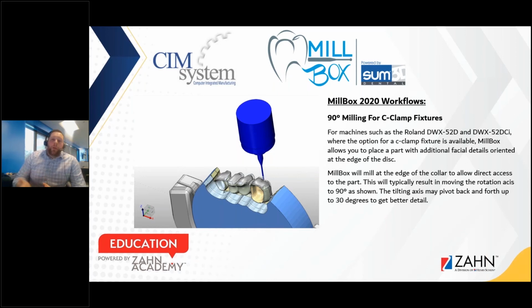So I really wanted to highlight this feature because it's a really good feature that allows us to increase the overall accuracy of the mill, and how what we design correlates with the final product after the mill. This is a great new feature that I think is going to work leaps and bounds, and it's a relatively easy feature to use. Unfortunately, I'm not able to show you, but it's pretty simple: you just nest it all the way out to the edge, select a few options, highlight the areas you would like to mill with this 90-degree option, and then it goes from there.